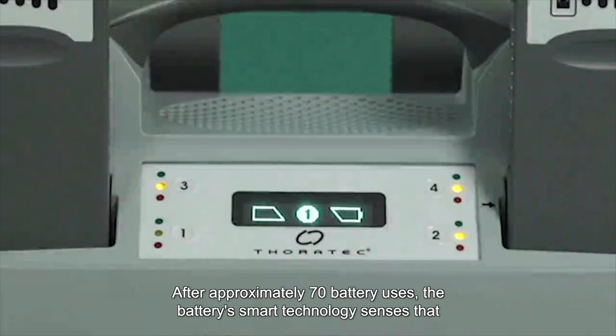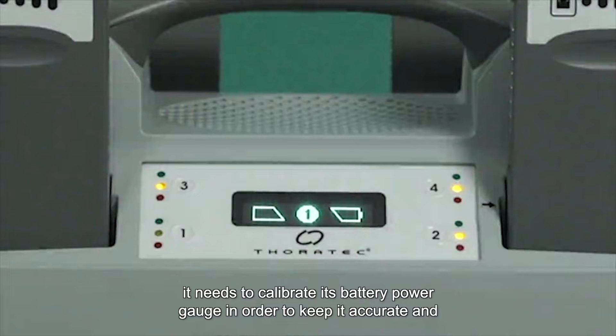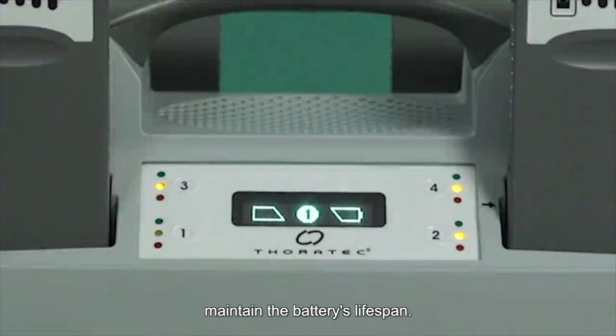After approximately 70 battery uses, the battery's smart technology senses that it needs to calibrate its battery power gauge in order to keep it accurate and maintain the battery's lifespan.